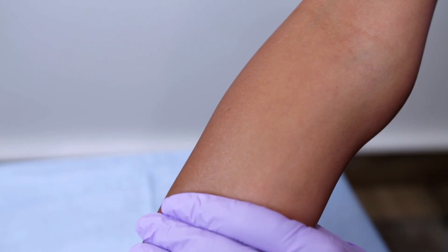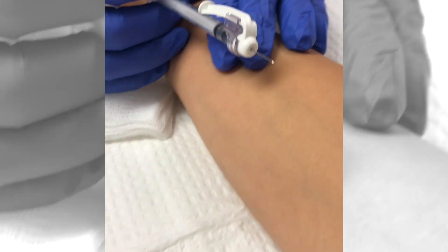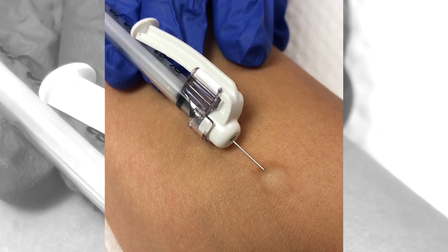Step three — let's administer the injection. A TB skin test is given intradermally on the patient's non-dominant hand of their inner forearm. I'll position the arm palm up and choose a site free of abrasions, injecting about two to four inches below the bend of the elbow — about four fingers below the injection site. I'll cleanse the site with an alcohol prep and let it dry. Don't forget to stretch the skin taut. With the needle bevel up at a five to 15 degree angle, I'll slowly inject 0.1 mils of solution and you'll notice it forms a small round bleb that looks like a blister.